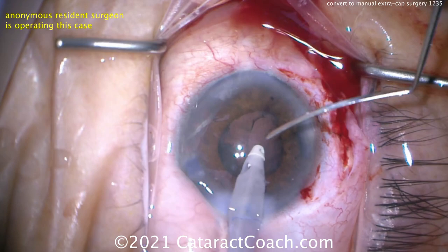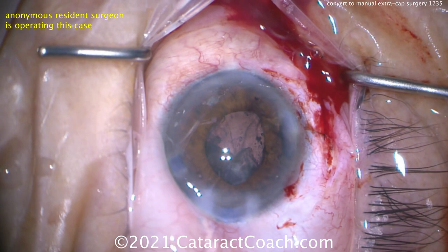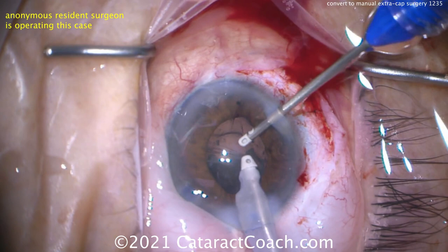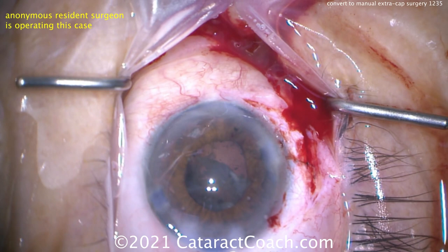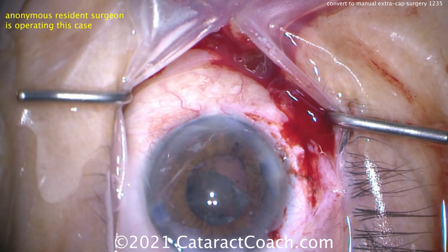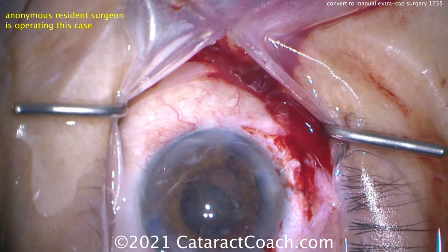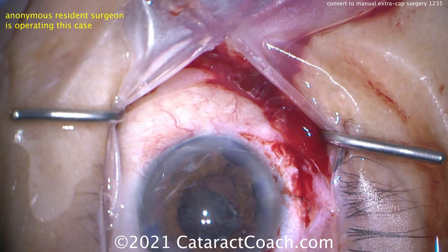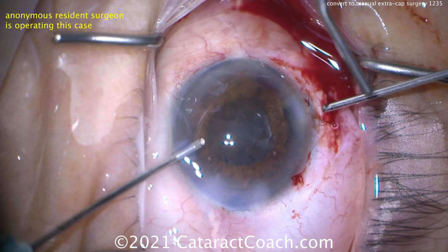There's certainly some vitreous coming through. Luckily not aspirating vitreous yet, but being super careful with very low settings. We don't want to leave cortex in the eye — some residents with a capsule break end up leaving a tremendous amount of cortex, and you do not want that. Now set up the anterior vitrector. You have two options: IA cut mode — position one is irrigation, two is aspiration, three is cut — used to remove lens cortex without cutting the capsule. The other mode is anterior vitrectomy — position one is irrigation, two is the cutter, three is aspiration — which helps avoid putting traction on the vitreous.